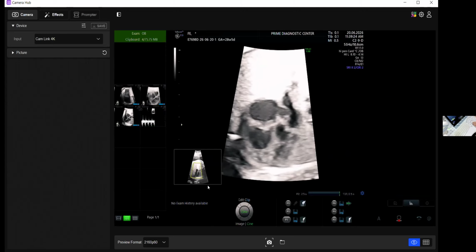Okay, so you should know how to take the diameters also. So this is the valve opened. Now this is the valve closed. Before it opens, here is the end diastole. Yeah, this is the place where you take. Now this is okay. That's the maximum when the mitral valve and tricuspid valve are opened. Tricuspid valve opens before the mitral valve. That is again high-end stuff.